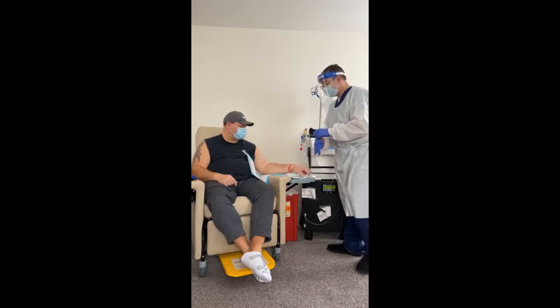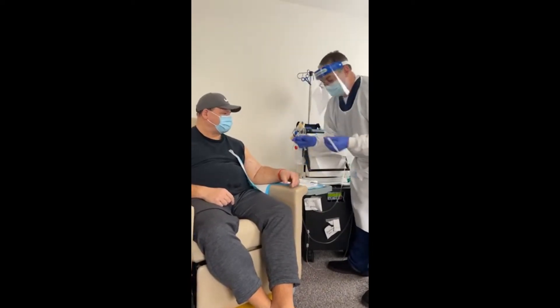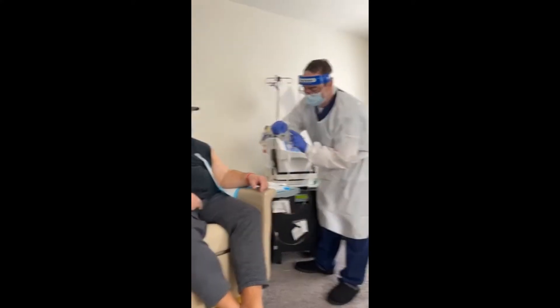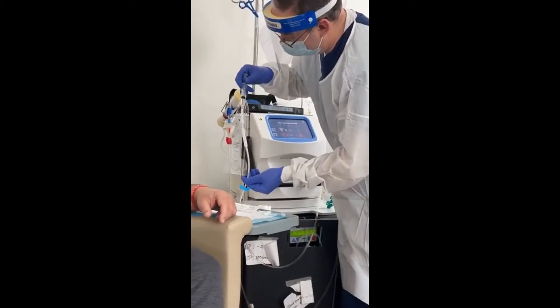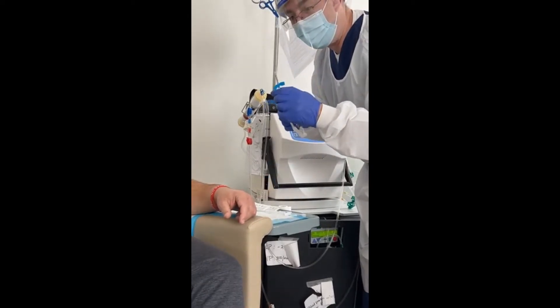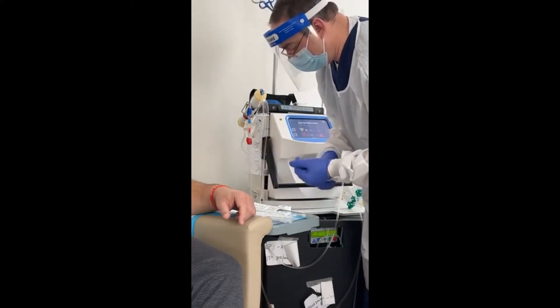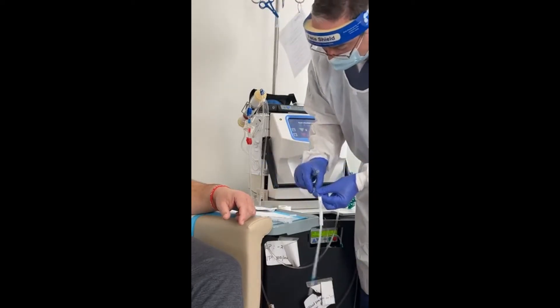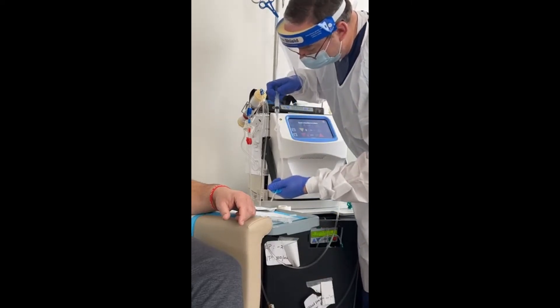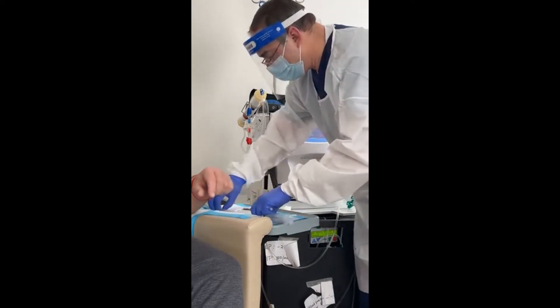We've got some normal saline flushes here that usually you would see me put in after we put the needle in. Today we're going to do it a little differently. We're going to take the cap off, put this syringe on there — this is saline — and push it in all the way until it comes out at the end. Now I've got a saline-filled syringe. I'll flush the saline in all the way up to the tip. My two syringes are ready to go.